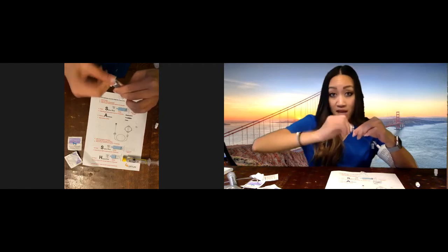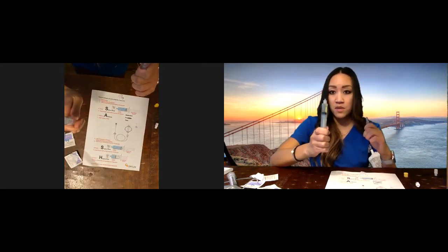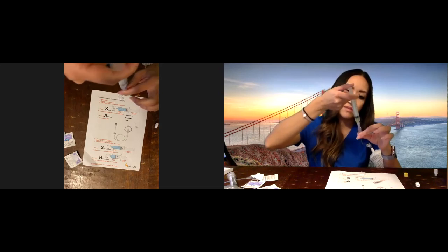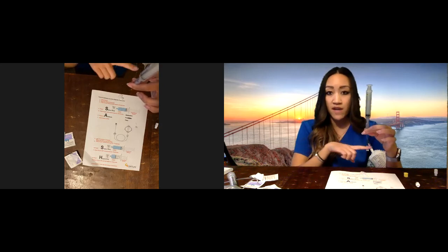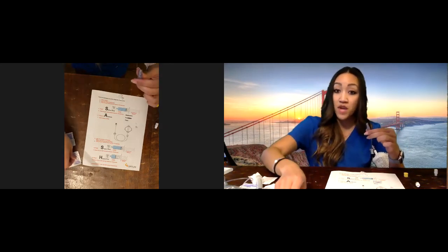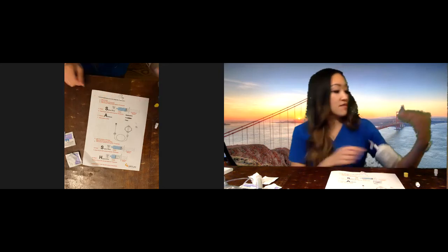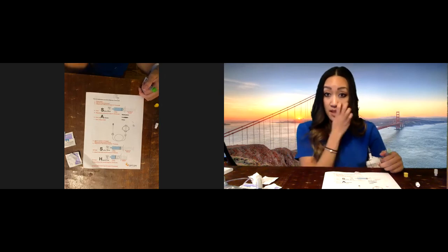When you're done, disconnect. Clean again, and if heparin is prescribed, flush the heparin — take out the air bubble, connect, push and twist. The reason heparin is the very last flush is because it coats your PICC line or midline to ensure there's no buildup. When you're done, disconnect, grab a new swab, and cap it off with a brand new cap. After that, clamp if there is a clamp, and then you're done. Everything gets disposed — nothing is recycled.